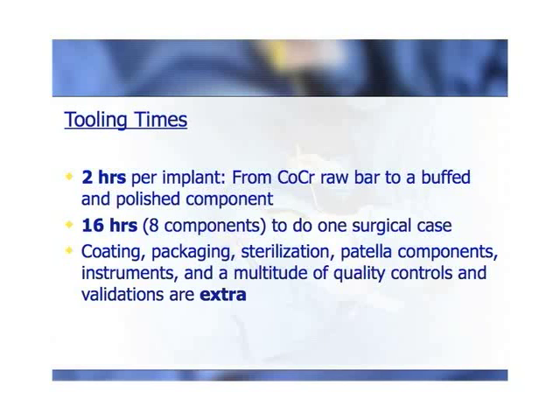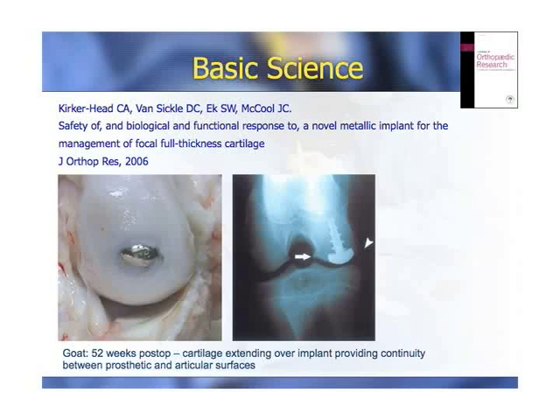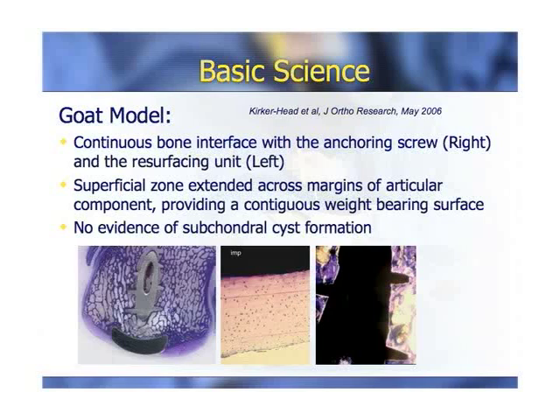Going from the basic science, the literature is very interesting. When you recess these implants, one of the things noted in the goat studies done initially, published in 2006, is that if these implants are positioned appropriately, recessed, you observe an overgrowth phenomenon of articular cartilage. In this study, when they looked at the photomicrographs, the superficial layer was continuous. Obviously, this is a smaller implant, but it is a very interesting phenomenon. I really don't have any explanation as to why that occurs, but this is organized cartilage, as you can see on the micrograph.